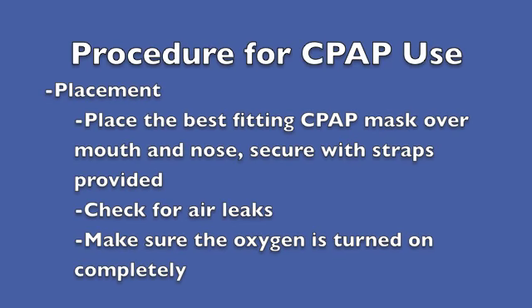Procedure for CPAP use. Place the best fitting CPAP mask over the mouth and nose, secure with straps provided. Check for air leaks. Adjust straps as needed. Make sure the oxygen is turned on completely.